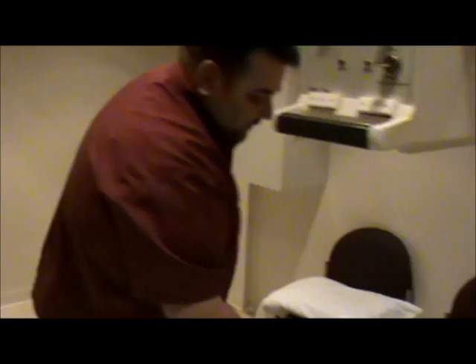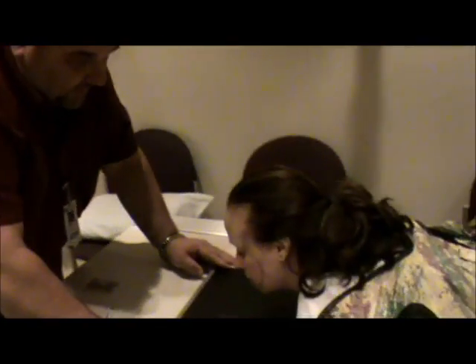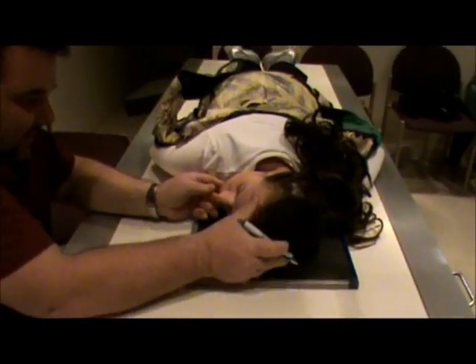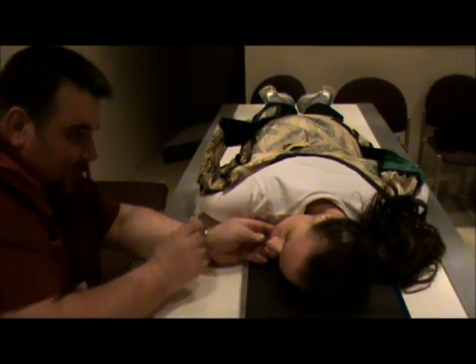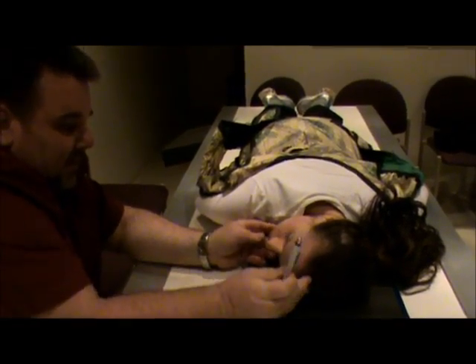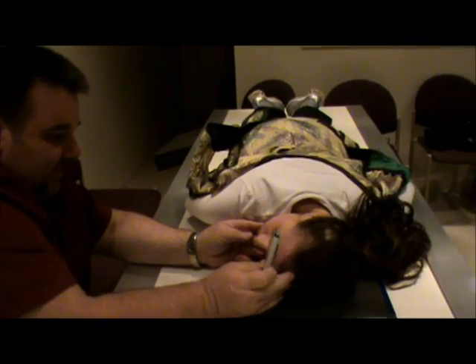Remember, it is tabletop — that's a common mistake. Now we're going to do our left lateral. I'm going to have the patient turn their head to the left, and we'll go through the progressions: IPL perpendicular, MSP parallel, and the IOML perpendicular to the front edge.